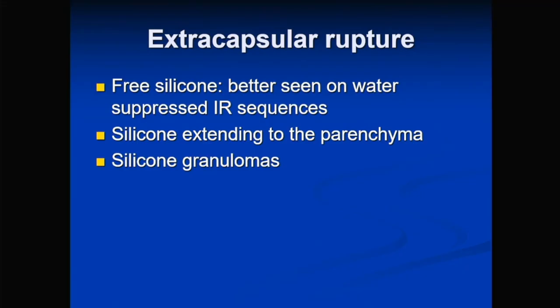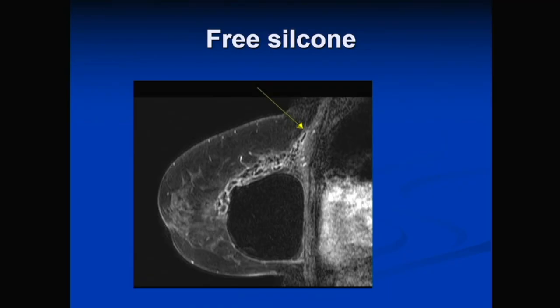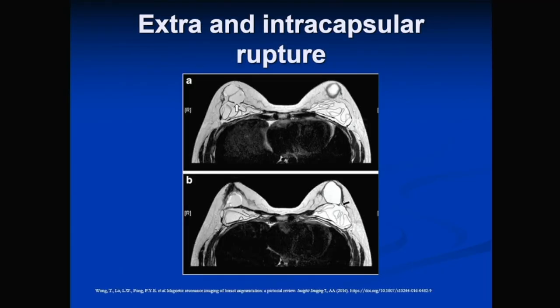Extracapsular rupture means there is free silicone in the breast, best seen on water-suppressed sequences. The silicone can float in the parenchyma or form granulomas. You can see free silicone that has escaped, with a dent in the fibrous capsule, confirming extracapsular rupture. In another example, extracapsular rupture has almost formed a silicone granuloma, with the implant contour completely lost. Bilateral breast implants can show both linguine sign and extracapsular rupture simultaneously.